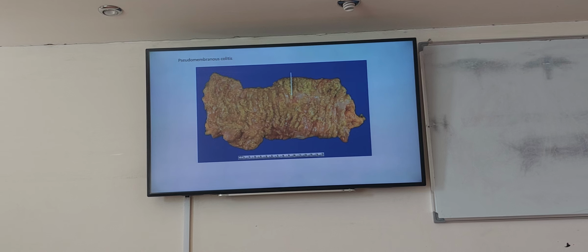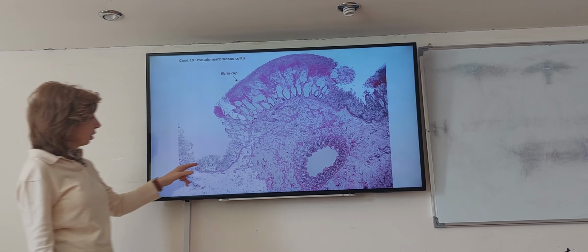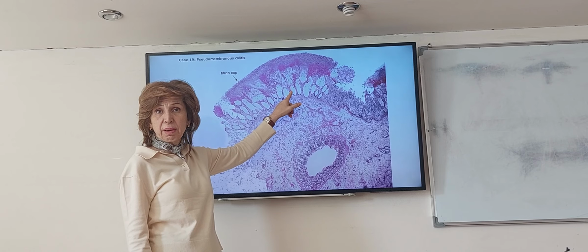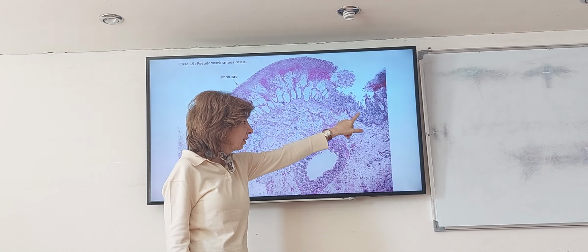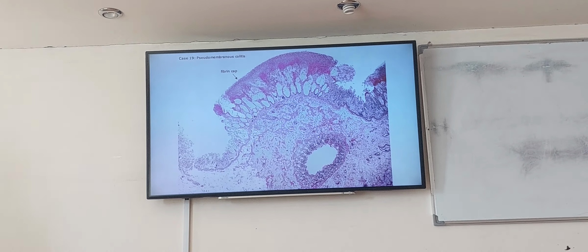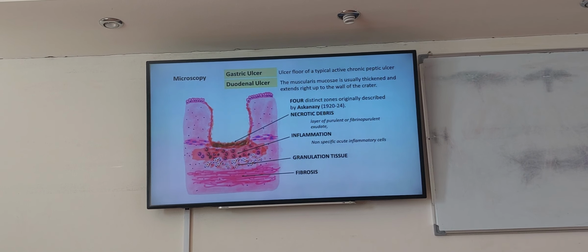Okay? Diphtheria, pseudomembranous colitis. Okay? This is a very good one. You see colon necrosis. You don't see nucleus. Remember? Non-nucleus necrosis with eosinophilic meshwork together, pseudomembranes. Look at here, colon is gone. Okay? Any questions? Now I will explain this. Please pay attention, this is important.